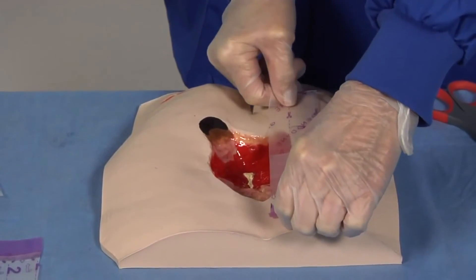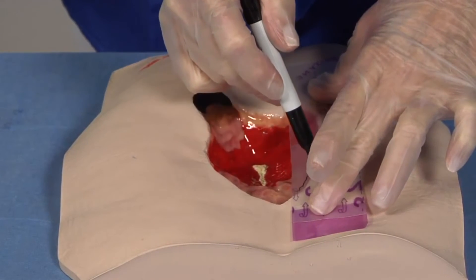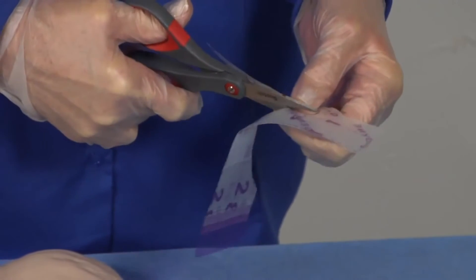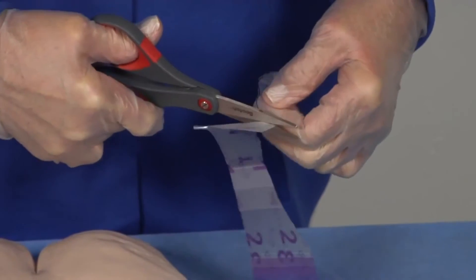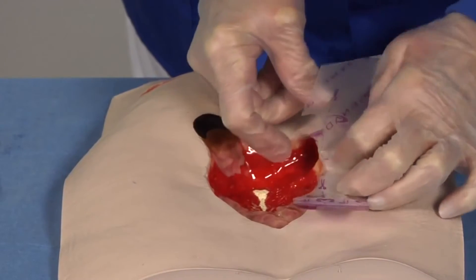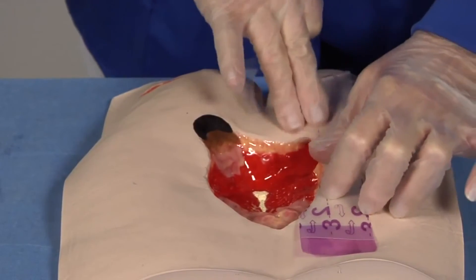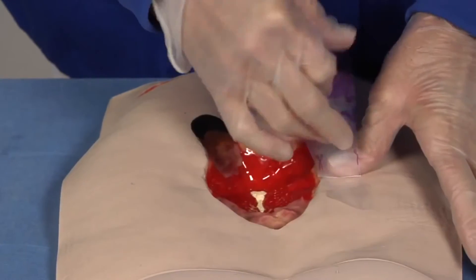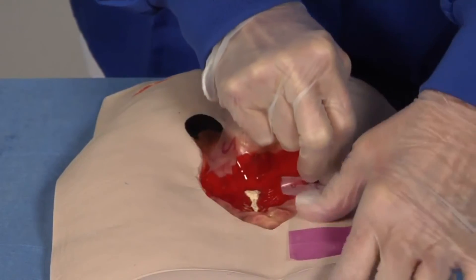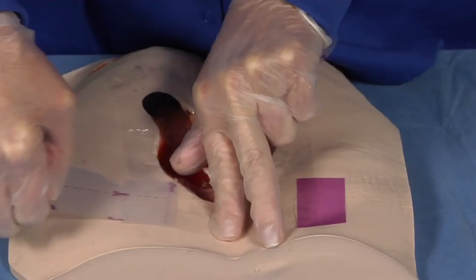To accomplish this, cut a strip of transparent adhesive dressing and place on the wound edge with the number one and two sides down. Trace the wound edge and trim the adhesive dressing accordingly. After trimming, lay the dressing pieces down, taking care not to overlap the adhesive dressing strips, and remove the tabs. Repeat this process around the entire wound edge.